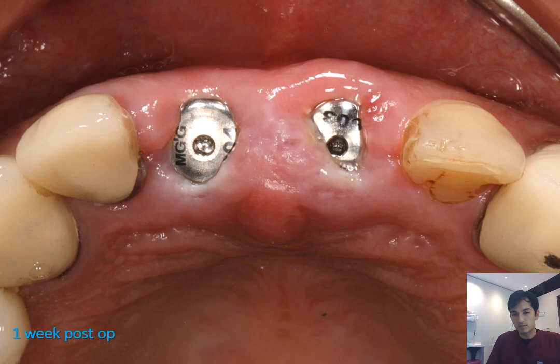In keeping with the surgical time being so short, the case was done in about 20 or 30 minutes. I can't remember exactly. You know that you're going to get less inflammation in the healing period, but also having the titanium highly polished healing abutments, there's very little plaque adherence to them. This is a patient with less than optimal oral hygiene, as you can see from the adjacent teeth, yet on the healing abutments they look perfect.